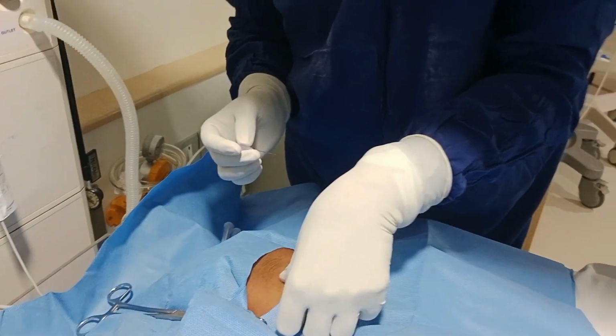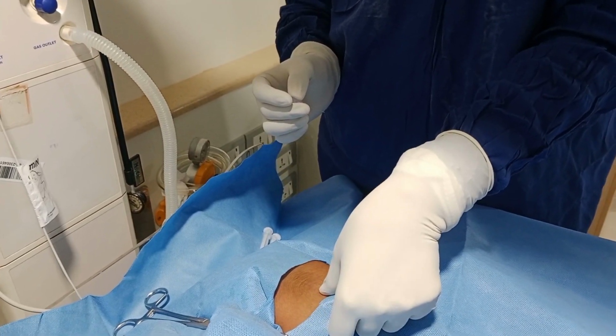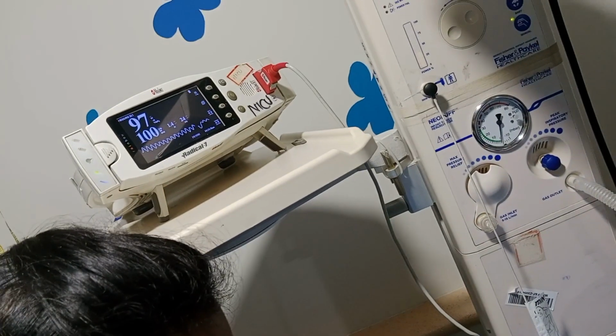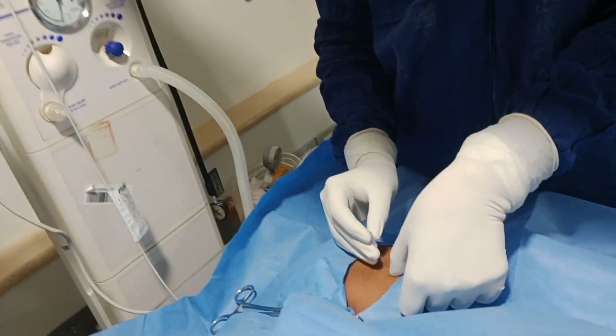Now Dr. Nirmal is performing the lumbar puncture. The baby is lying in prone position and all vital parameters are being monitored. They are perfect.